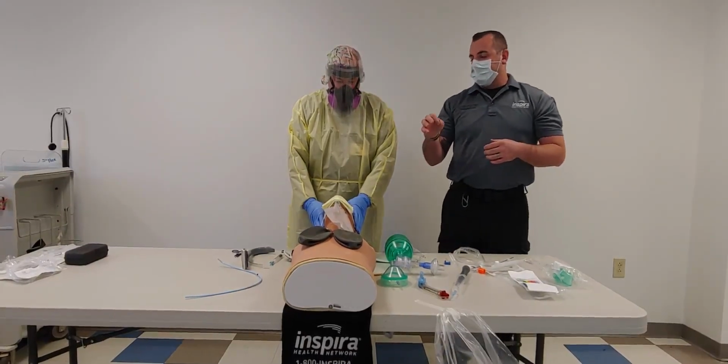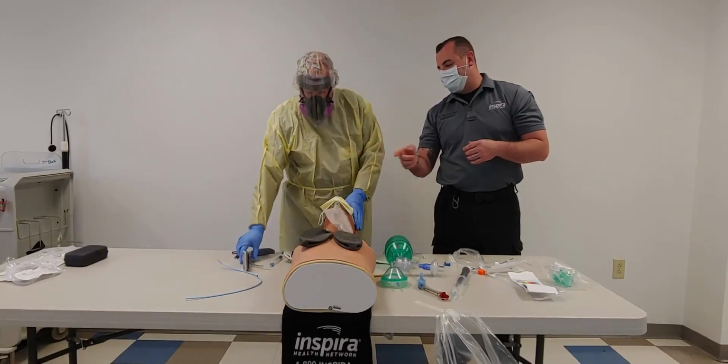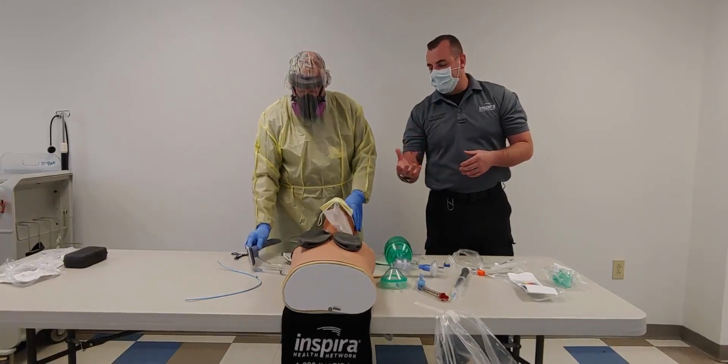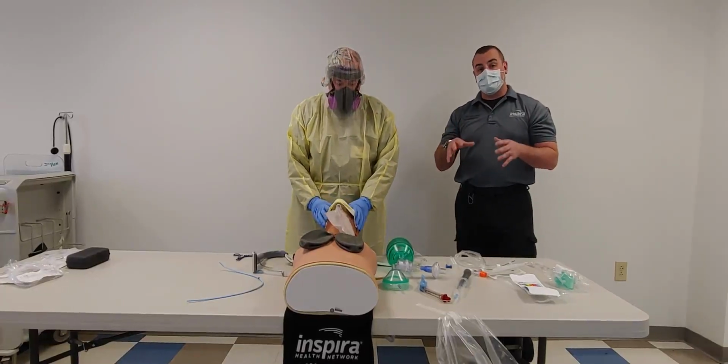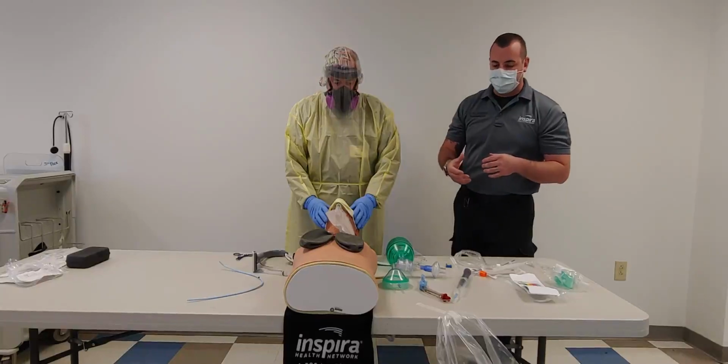All right, our video laryngoscopy system is the King Vision. You just grab that real quick. We use a King Vision. Somebody may use something a little different. It all depends, but video laryngoscopy has become the gold standard for a COVID patient because it helps minimize that aerosolization of potential airway particles.